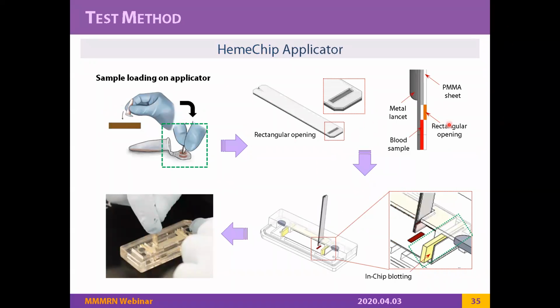I'm going to briefly talk about this. This is a controlled capillary device that allows us to transfer the sample here. And we also have some additional techniques that help us maintain the wetness of the hemoglobin separation medium, which is very crucial for the test.